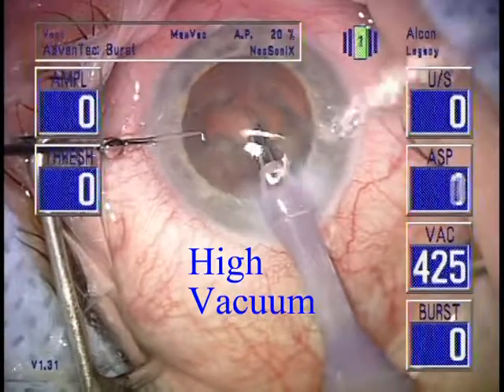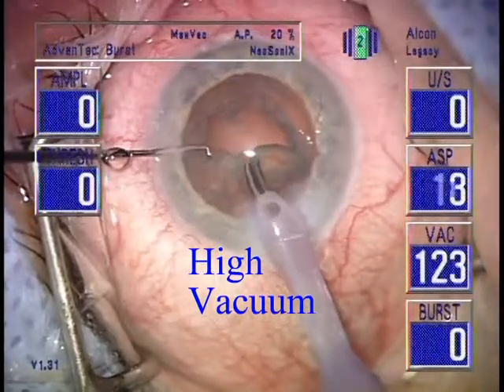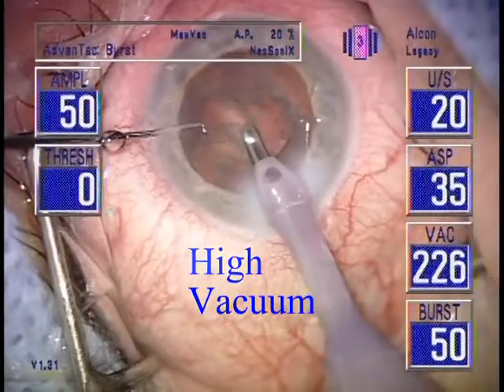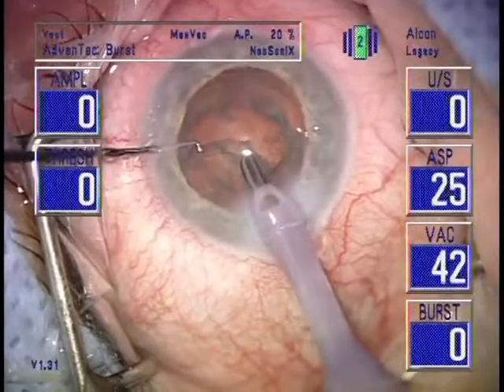With high vacuum and non-thermal surgery, the occlusion bell is to be ignored. Occlusion is the desired goal to enable vacuum cutting to occur.